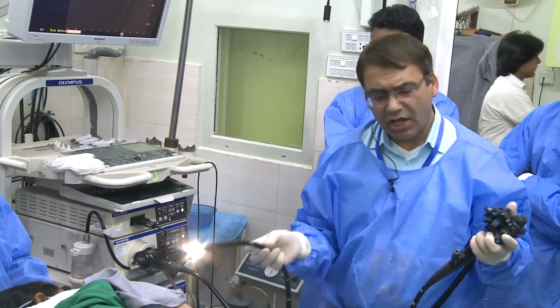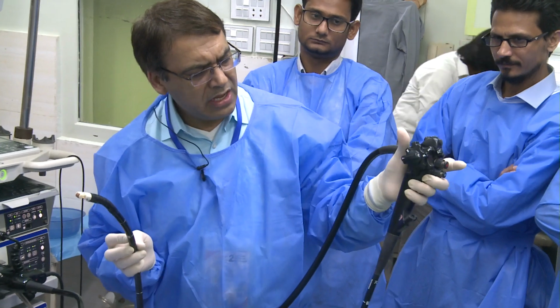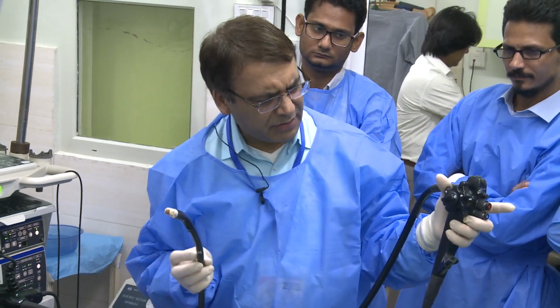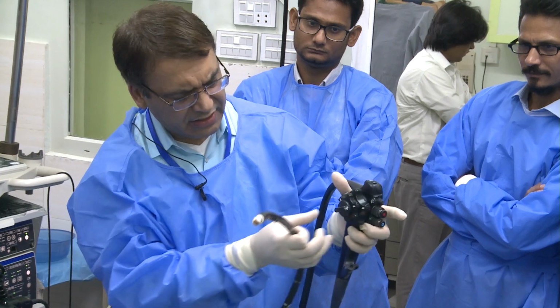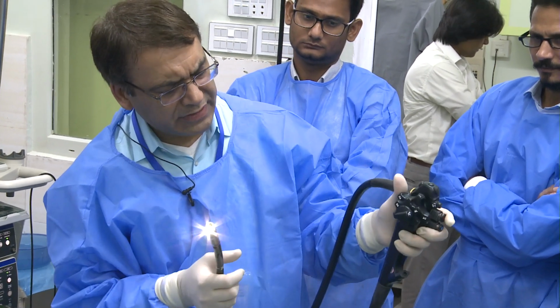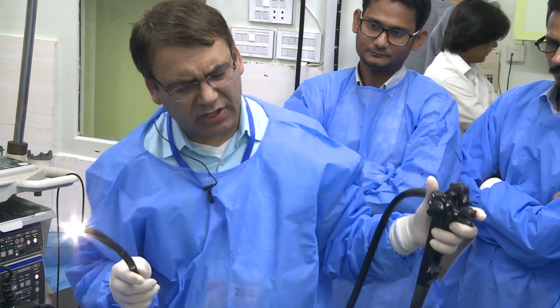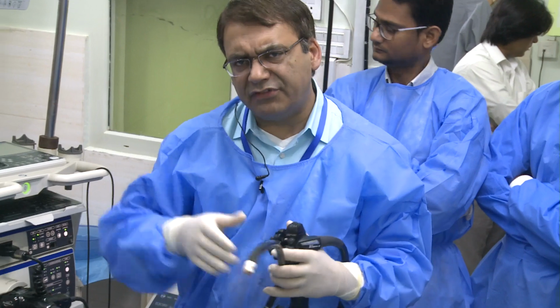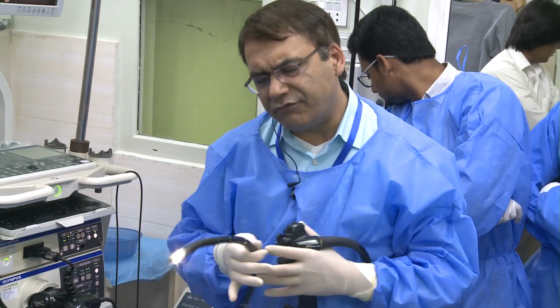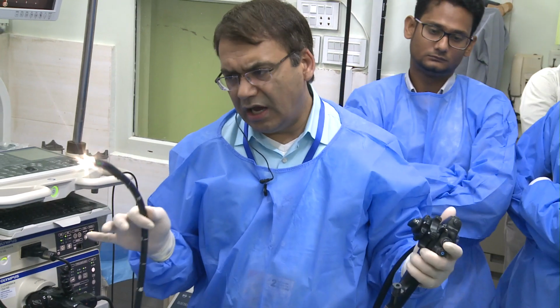how I do it. So here, I try to control these wheels. Obviously, if somebody has short hands, and especially in women, sometimes it's hard to control the elevator and wheel at the same time. You can use your right hand, but you're going to see that I try my best to not have to, at least most of the time, control the scope with my right hand.